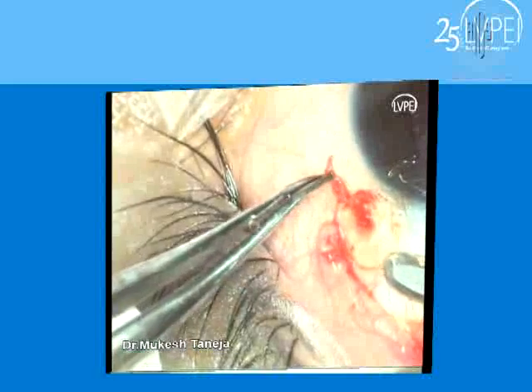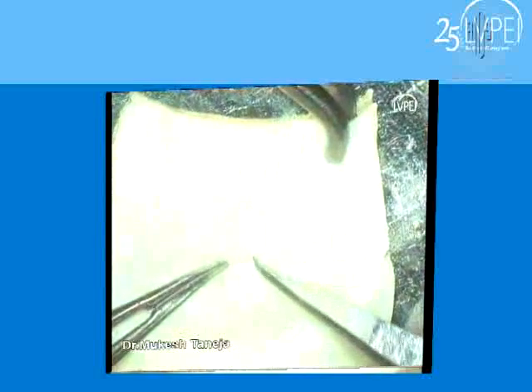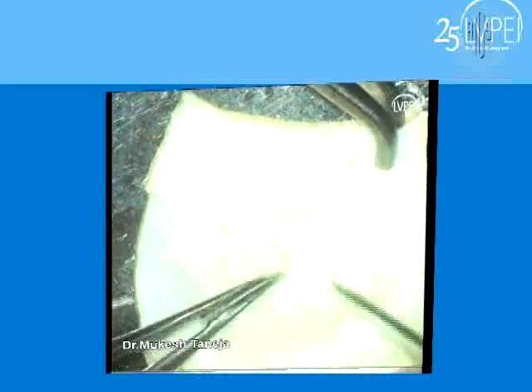And once this is dissected out, he used the same punch onto donor sclera, and he's already marked the outline. He's just using the help of a blade to sort of delineate the edges of it, and he's going to prepare a lamellar kind of small patch, a rounded scleral patch, which he's going to put on the area of the deficit. And this is very tiny, it's about 3 millimeters, so you just need to put it back in place with fibrin glue.